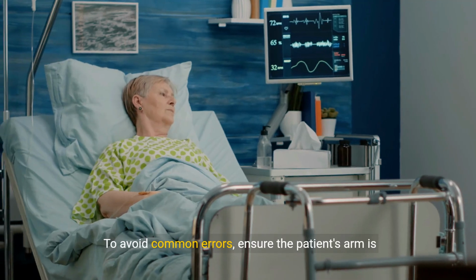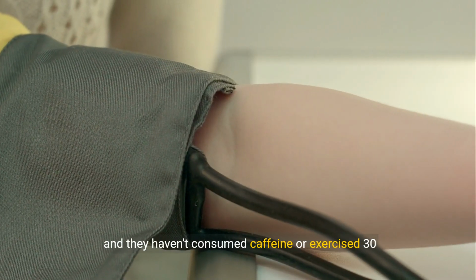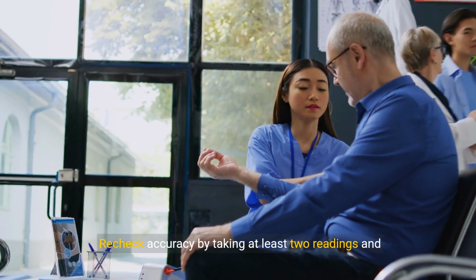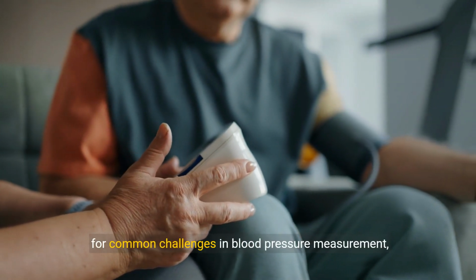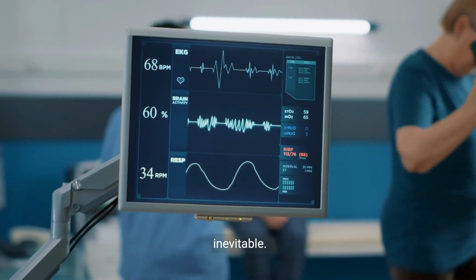To avoid common errors, ensure the patient's arm is at heart level, they're relaxed, and they haven't consumed caffeine or exercised 30 minutes prior to the measurement. Recheck accuracy by taking at least 2 readings and averaging the results. As we move forward, you'll find practical solutions for common challenges in blood pressure measurement, ensuring your readings are always precise. When measuring vital signs, challenges are inevitable.